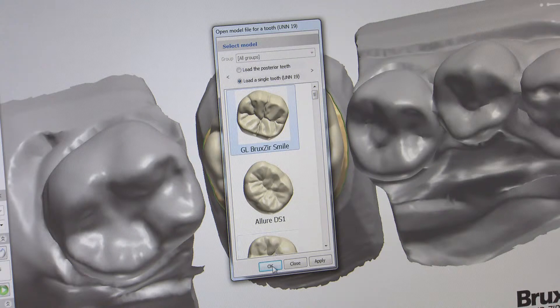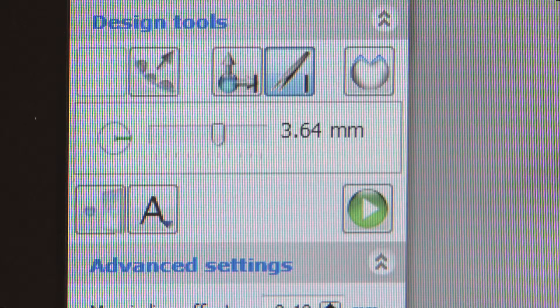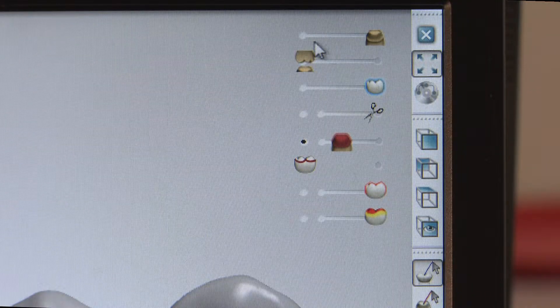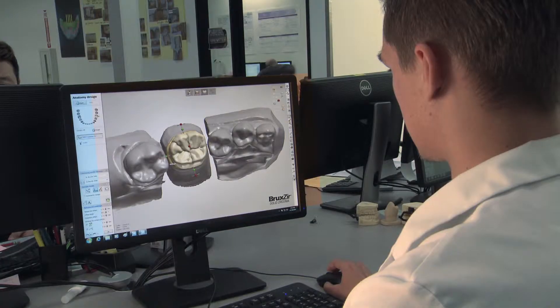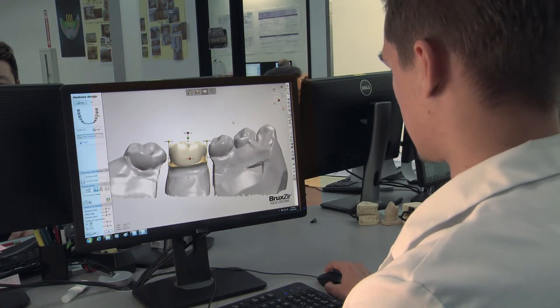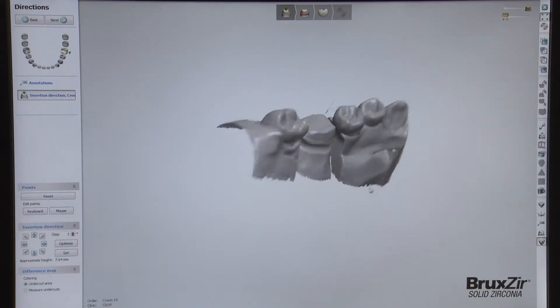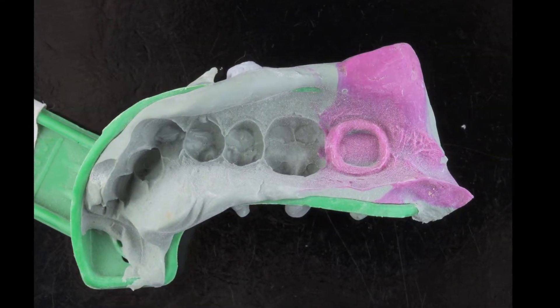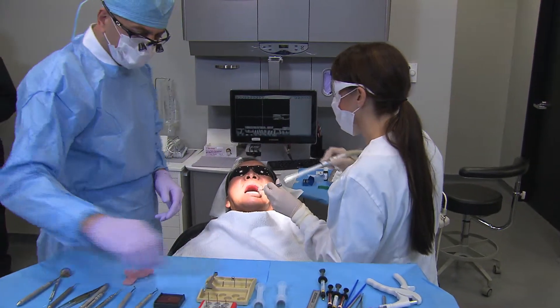At Glidewell Laboratories, we combine a comprehensive proprietary digital library of tooth shapes and occlusal patterns with the robust toolset provided by dental designer software. These tools allow for the expert crafting of ideal contours and a natural emergence profile without extended lab time. The virtual models reflect the exact dimensions of the impression taken chair-side with no fear of elastic or thermal deformation, so a precise, accurate fit is achieved for the final prosthesis.